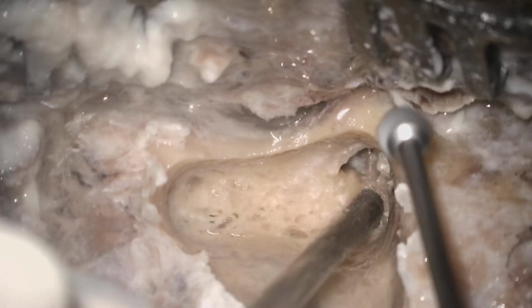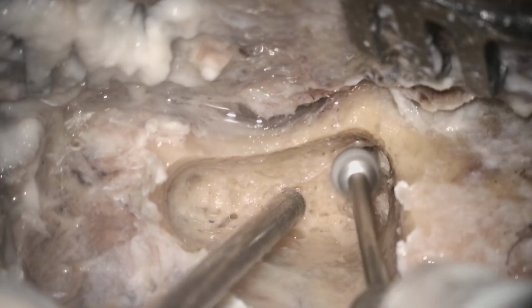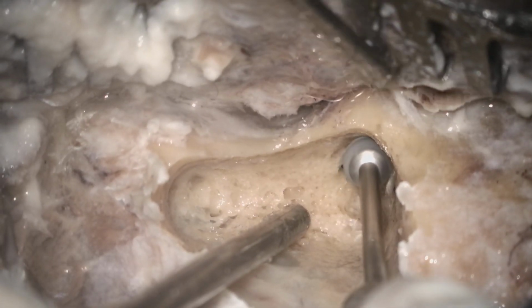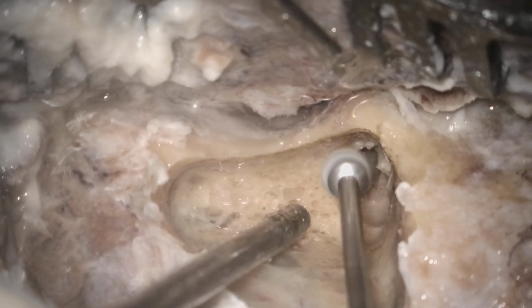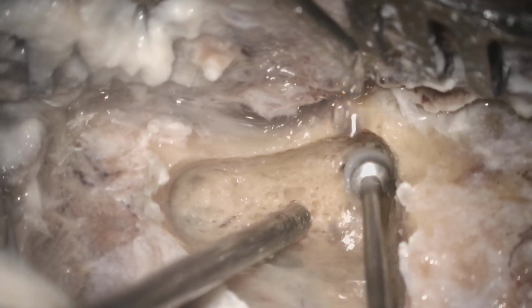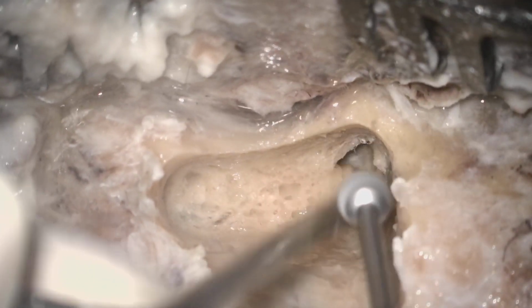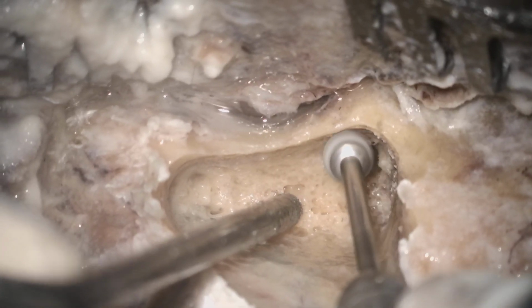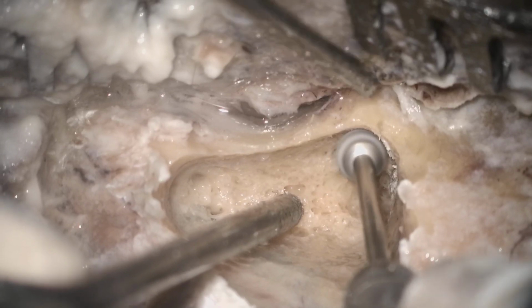So this is the mastoid area. This is the lateral semicircular canal, and when you are drilling in that part, always drill like that. Start your bar from medial and come slowly up to the lateral part. So always go medial to lateral, because if there is any jerky movement or if your bar slips from your hand or you have a slippage of the handpiece, then it will go outside.